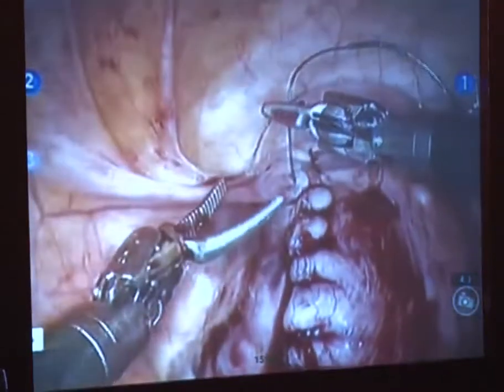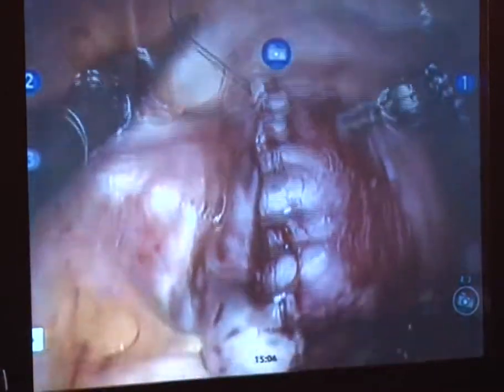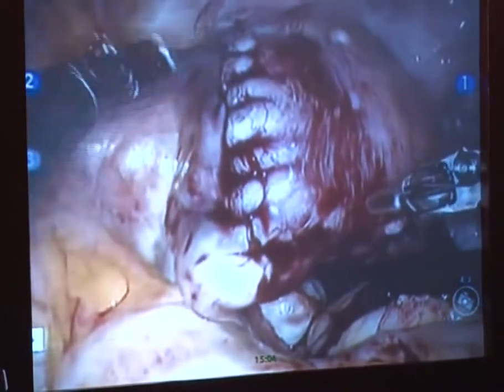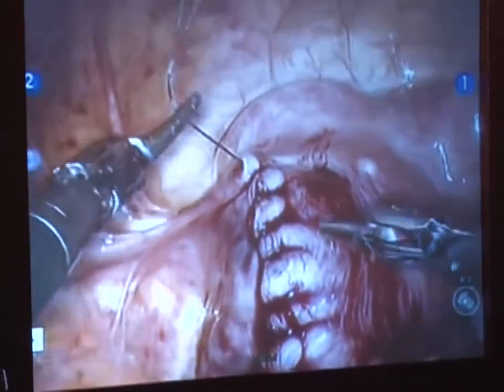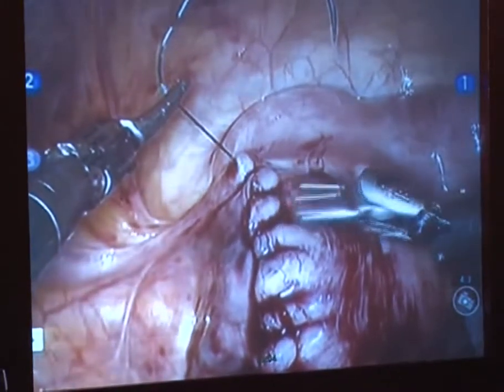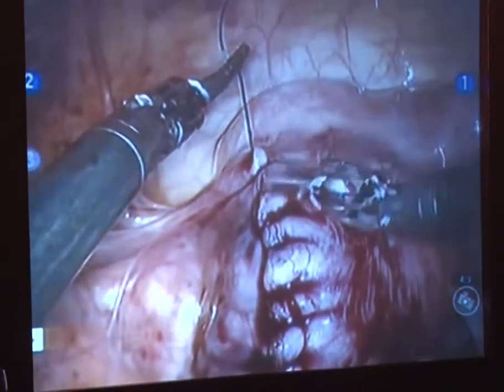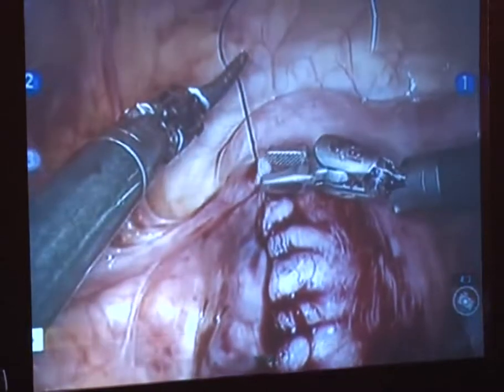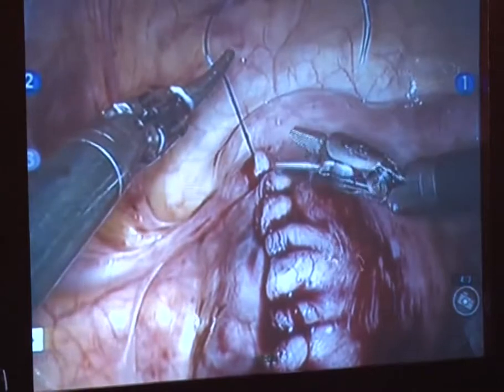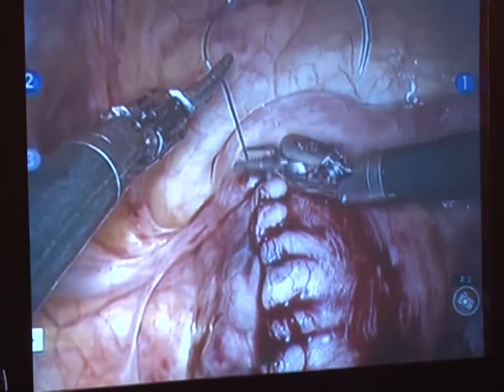Cut that serosa a little bit there. Close that. It looks like the serosa is bleeding right here. Okay, so what I'm going to do now is leave this needle and we'll pull it out at the end when we morcellate. All I do is keep inventory, and we will just pack this in the peritoneum here in the gutter, and then just leave it right there. Come back for that at the end of the case.